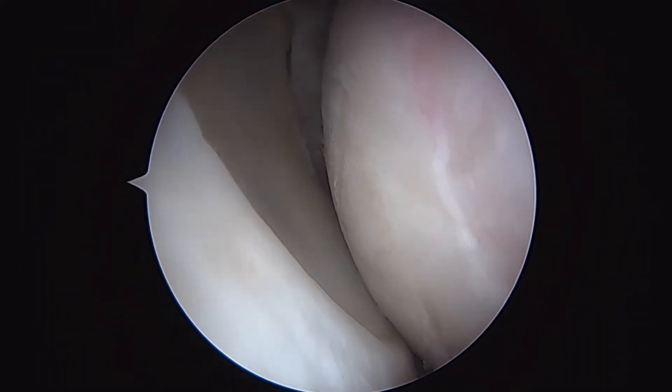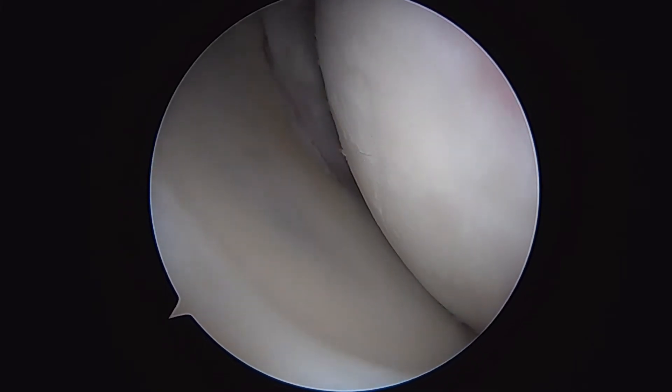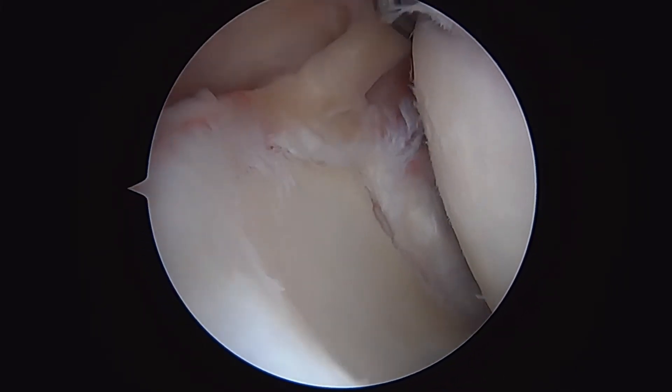We're going to flip our eyes around, coming up — there you can see the inferior labrum, all the way around the back at the posterior labrum.